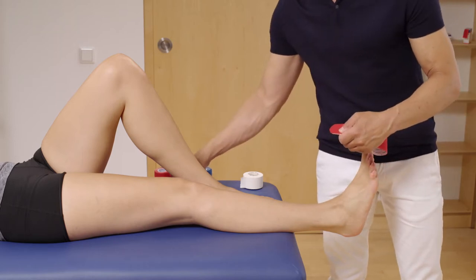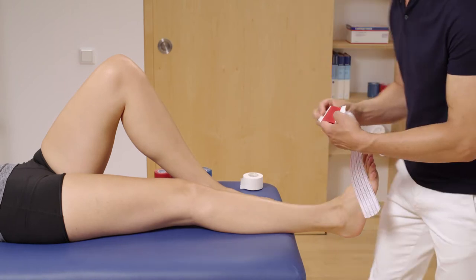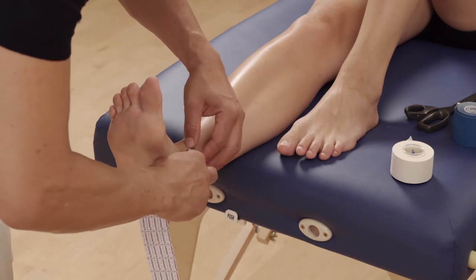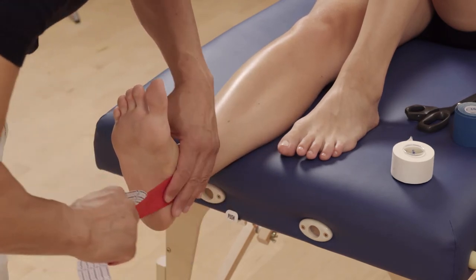Tear off the paper a few centimeters from the end. Attach the tape to the inner malleolus and stick it on without tension. Gradually remove the remaining paper and place the tape around the sole to the lateral side of the foot.